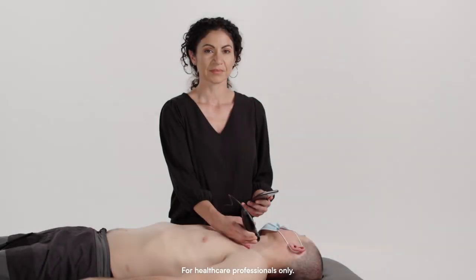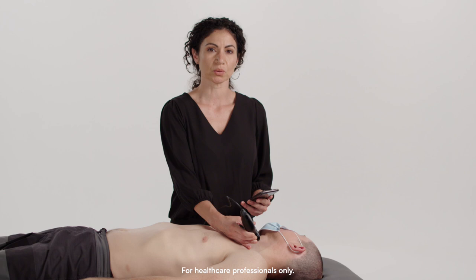I'm Teresa Lopez. I'm a clinical product specialist with Butterfly and today I'm going to show you pulse wave in the carotid preset.